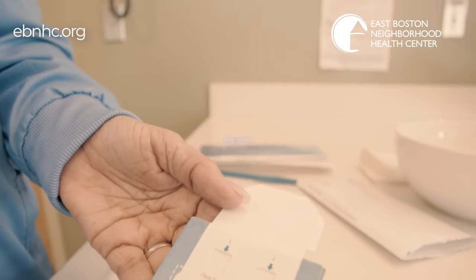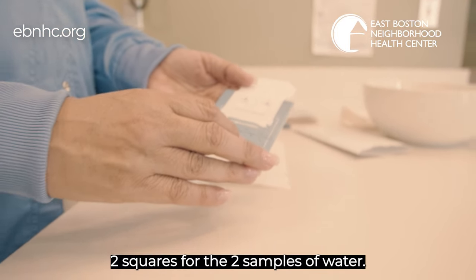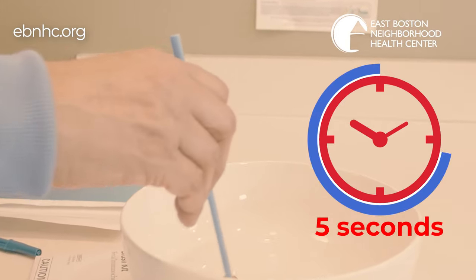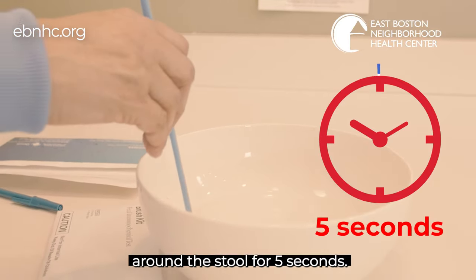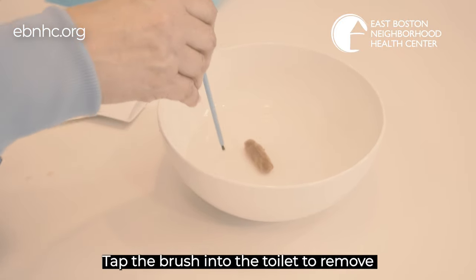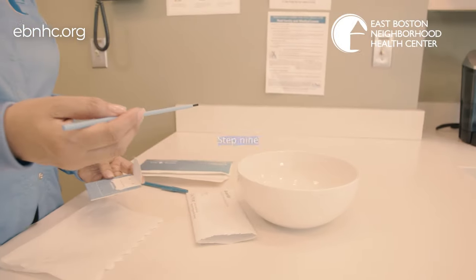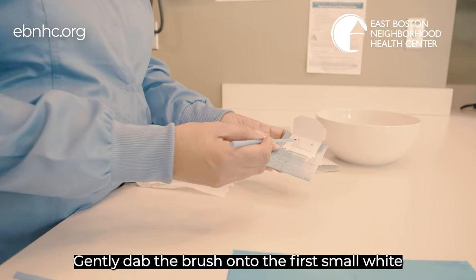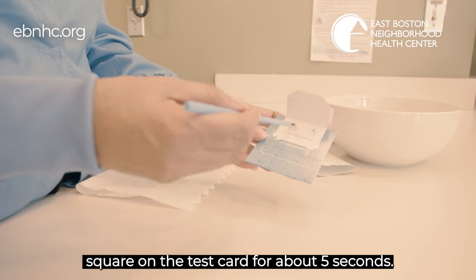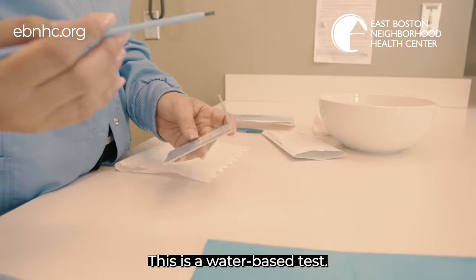Step 7: Lift the flap of the test card. You will see two squares for the two samples of water. Step 8: Using one of the blue brushes, brush the water around the stool for five seconds. Make sure you do not pick up any of the poop on the brush. Tap the brush into the toilet to remove excess water. Step 9: Gently dab the brush onto the first small white square on the test card for about five seconds. Remember, make sure you do not put any poop on the square. This is a water-based test.